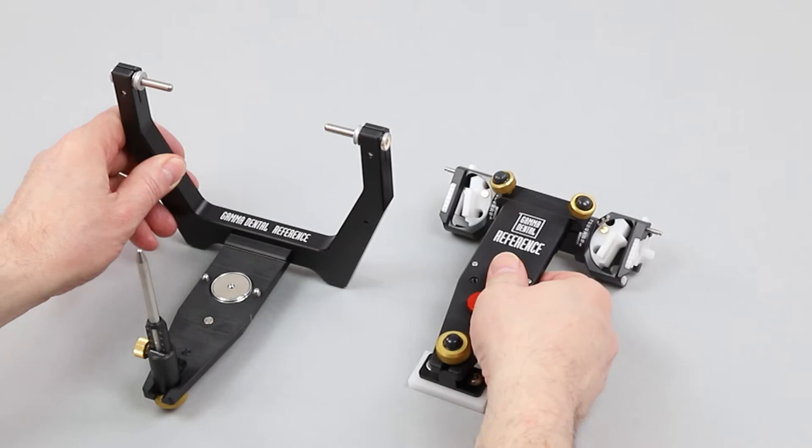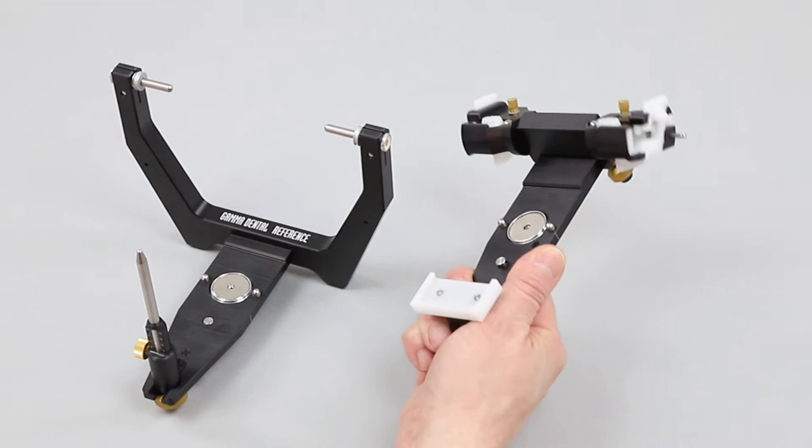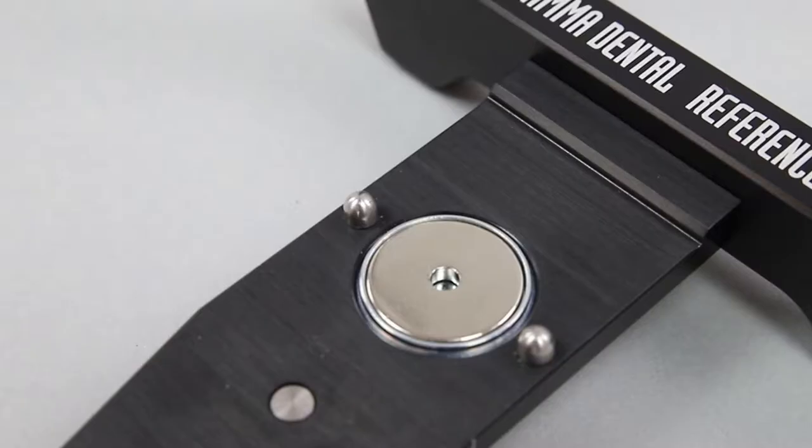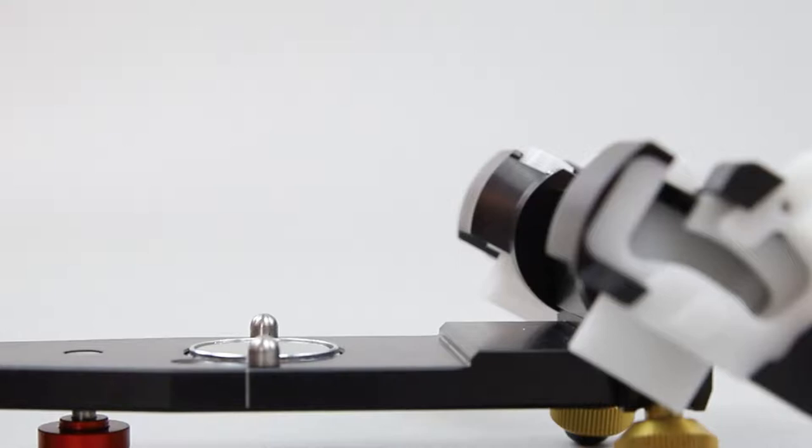Basically, the articulator consists of an upper and lower member. Both members of the articulator are equipped with a magnetic retention system for attaching the articulated casts.